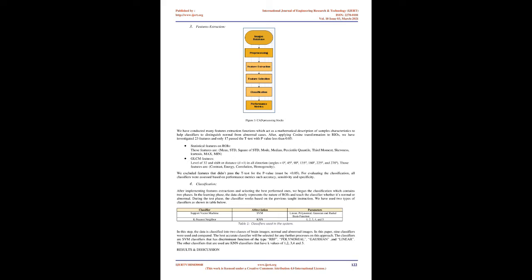Suhag, S., and Saini, L12 improved a system that automatically detects and classifies brain tumor using a MATLAB GUI tool into normal or abnormal, then classifies the abnormal into gliomas, metastasis, and astrocytoma. The proposed system started with pre-processing the image to denoise and smooth the edges using median filtering. Then fuzzy C-means, FCM, was applied for segmentation.